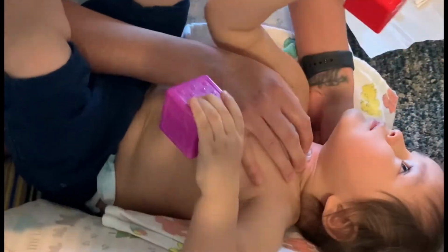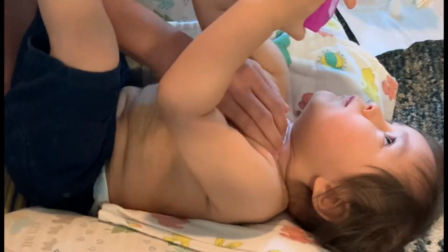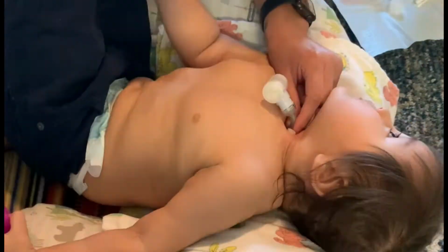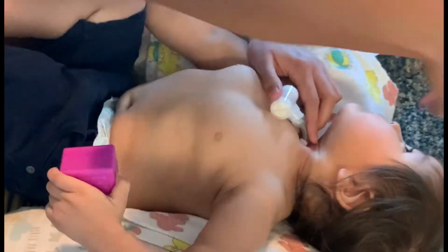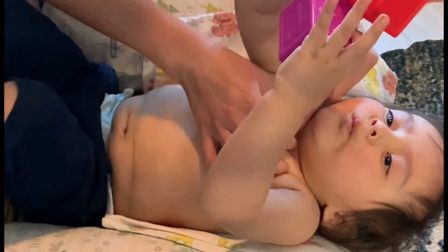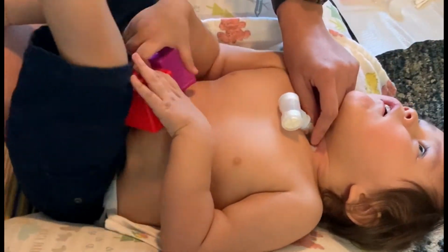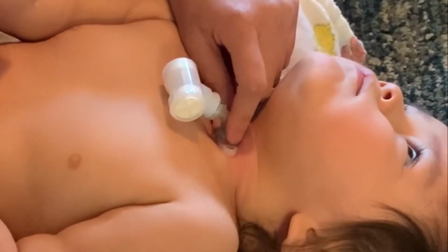In this video, Xander was everywhere. He usually sits still pretty good doing his tie change or a trach change, but not this time. And I'm actually kind of glad, just because it shows you guys how much control you need to have in the placement of the trach, so that way it doesn't actually pop out while doing a trach tie change or the trach change. Next is the trach change.